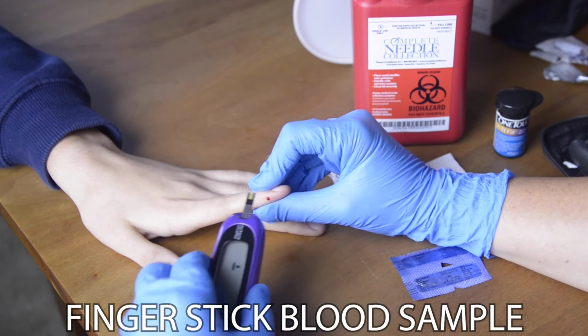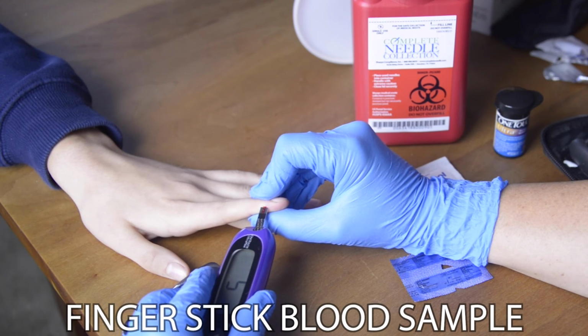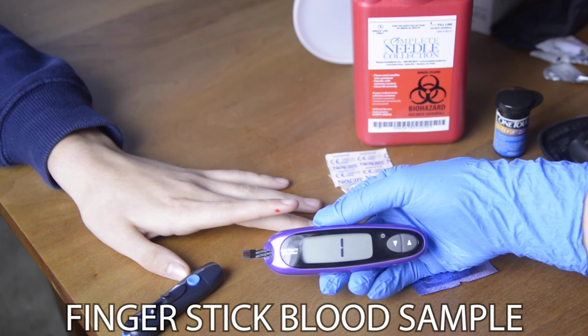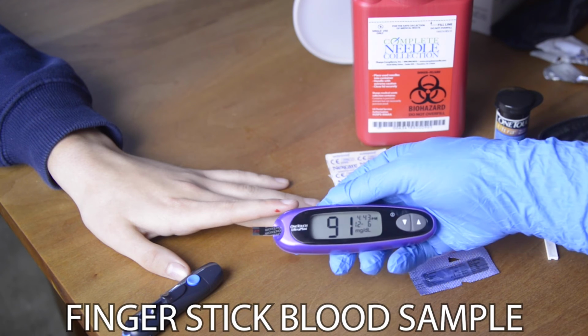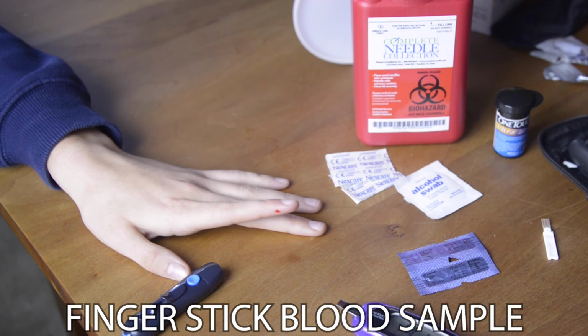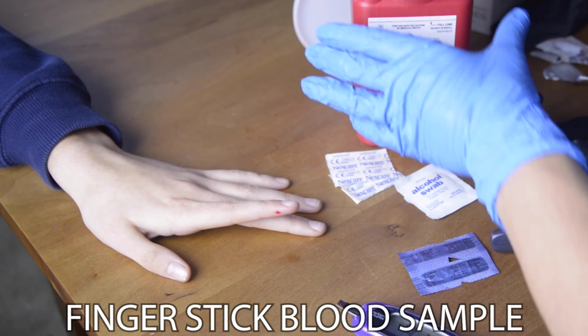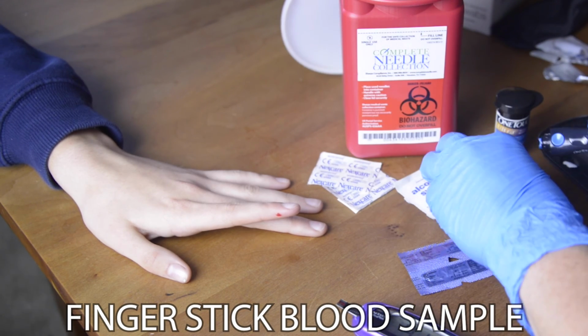Too small a drop and we will not get a sufficient sample. That's a good one. Ready for sharps.